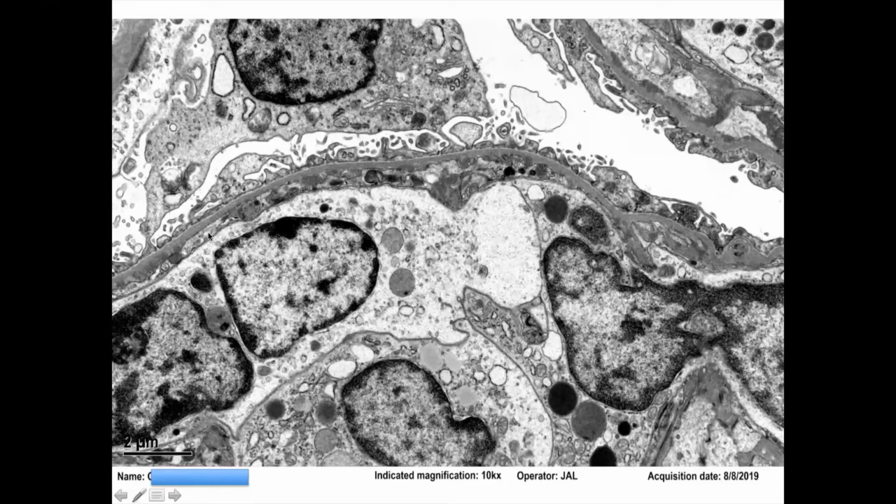ولما يصير عندكم هذا later on in membranoproliferative glomerulonephritis اللي هو على silver stain, as you guys know, الترام tracks اللي هو الدبل كونتور, basically because هذا اللوسنسي بداية الانجري. بعدين glomerular basement membrane, it will try to kind of like heal itself, and it will rebuild another lamina densa. فبيكون عندنا double lamina densa, and that is why we have this tram track appearance, duplication or double contouring of the glomerular basement membrane, basically because of this injury that happened to the glomerular basement membrane.